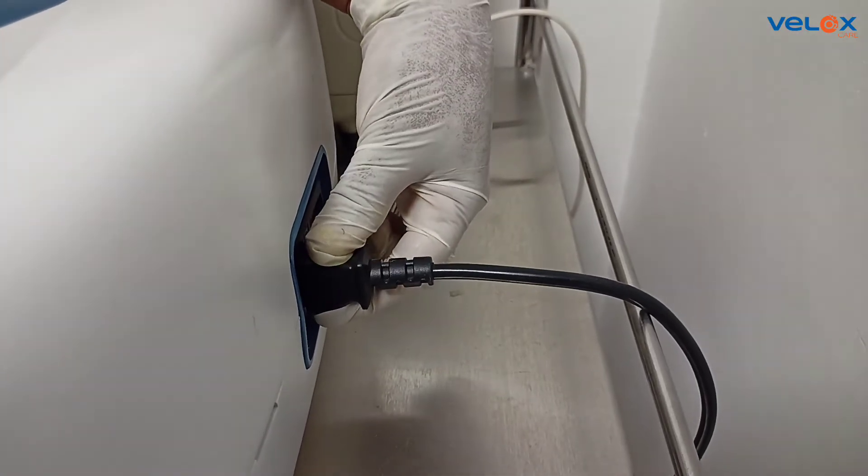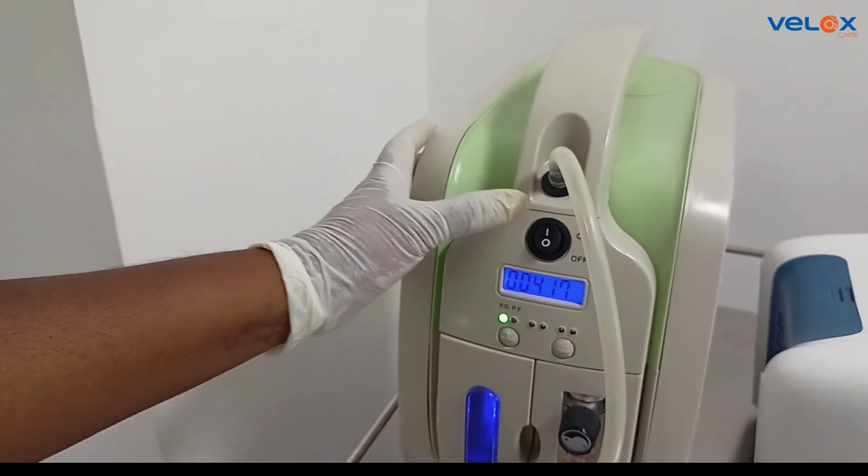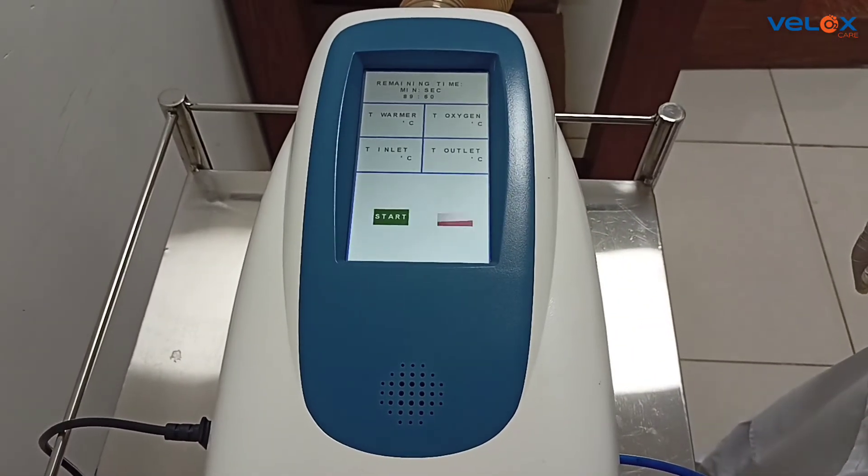Plug in the switch and turn it on. Switch on the oxygen generator. Switch on the warmer. Click on the start icon to begin the therapy.